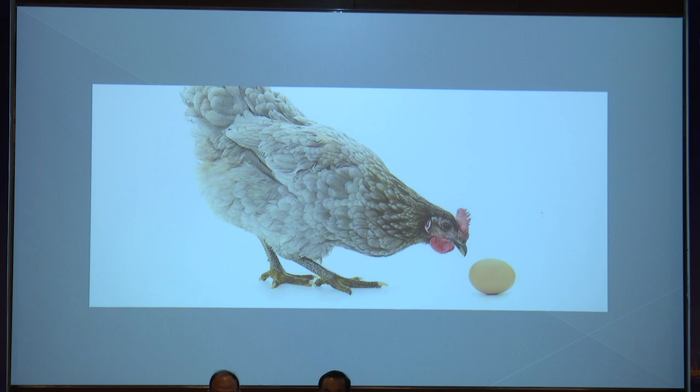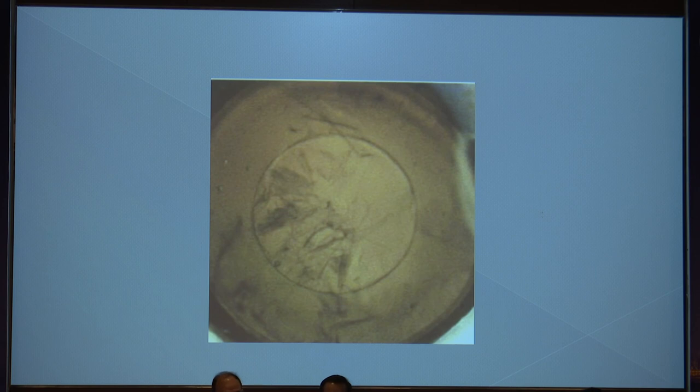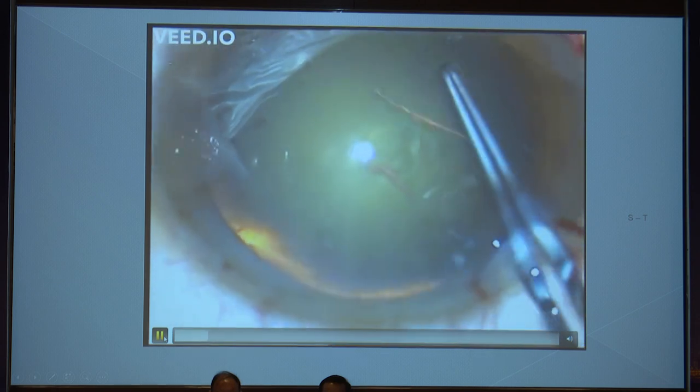We should remember that phaco came much before rexis. Rexis was developed much later. Before that, everyone used to do phaco with a can opener capsulotomy. But then can opener capsulotomy has a lot of disadvantages. This was realized over time, and therefore it evolved into a CCC, the continuous curvilinear capsular rexis. So the rexis can run away at any point of time.